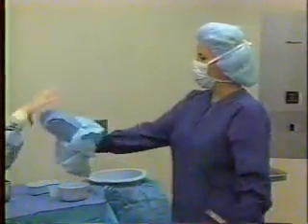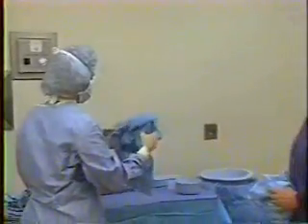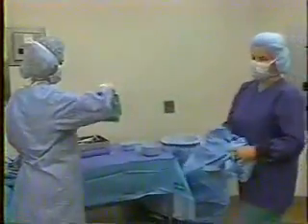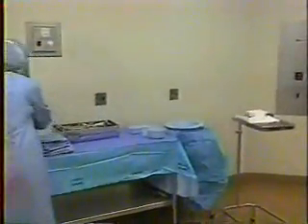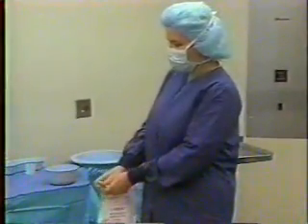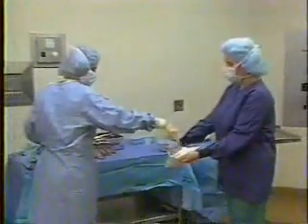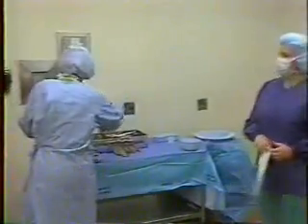Extend the contents toward the sterile person so he or she can lift it away from the package cleanly without touching the wrapper sides. In opening peel packs, separate the edges by rolling them back over your hands. The sterile contents can then be offered to the scrub person in a way that minimizes the possibility of touching the unsterile edges.